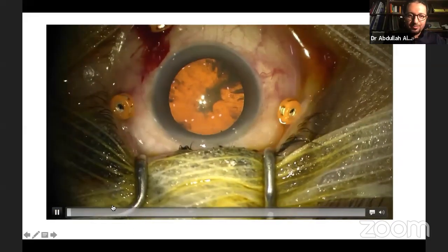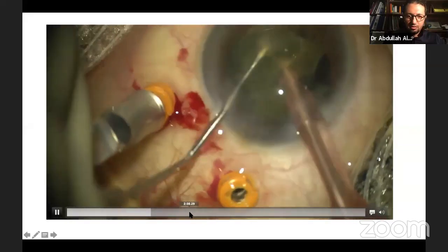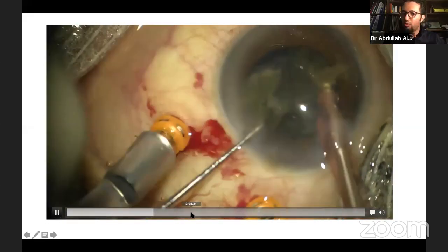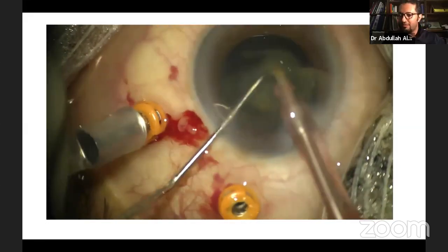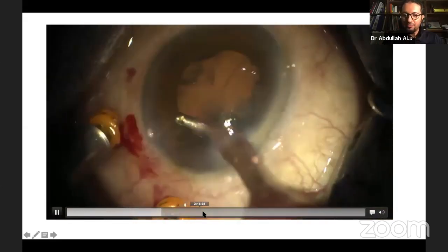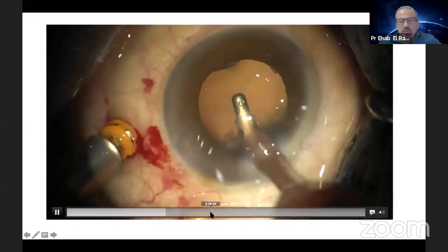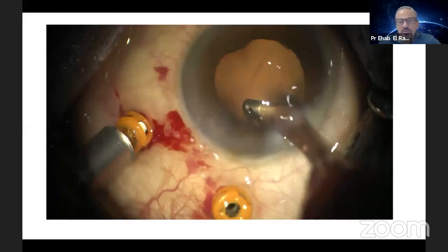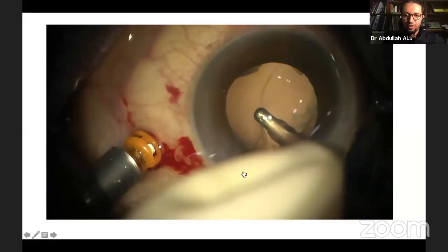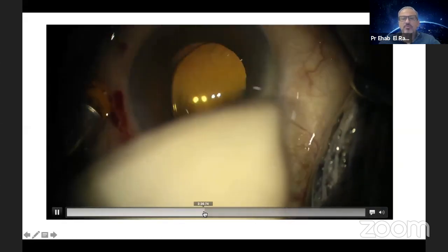This is a combined surgery. We don't need to see the cataract. Of course, we all put the trocars before the cataract surgery. Do we all agree? Prof. Ihab, do you put trocars before cataract in a combined surgery? No. Well, now really I put them because I don't feel that they interfere with doing the phaco, so I put them before. At least infusion, maybe. The infusion without opening the infusion. It doesn't make a difference even if you put all three of them.